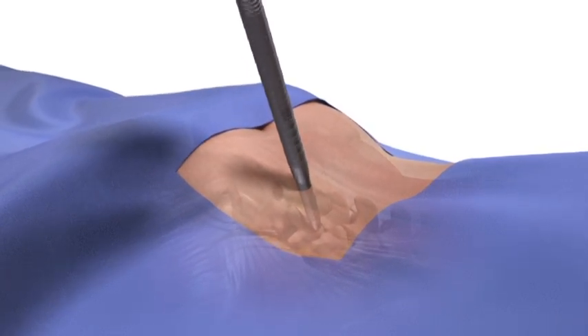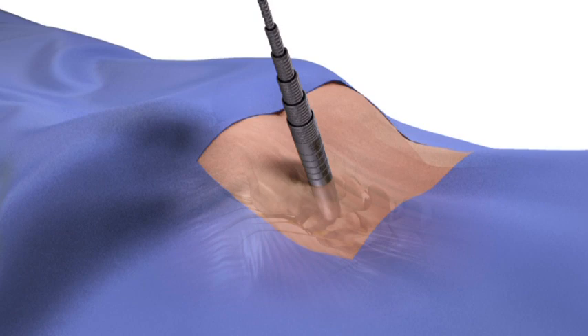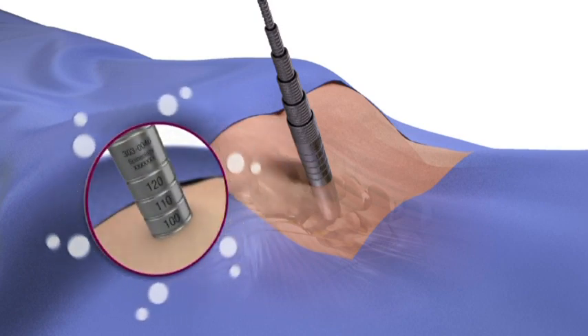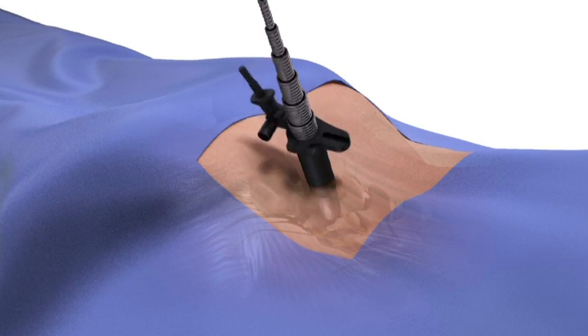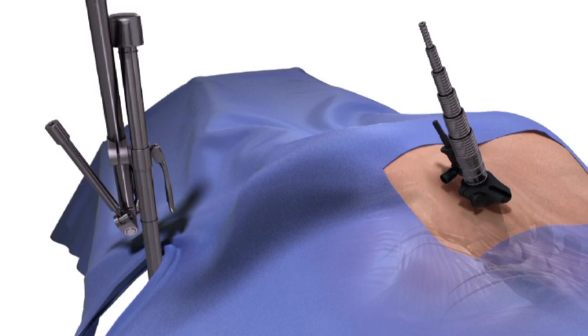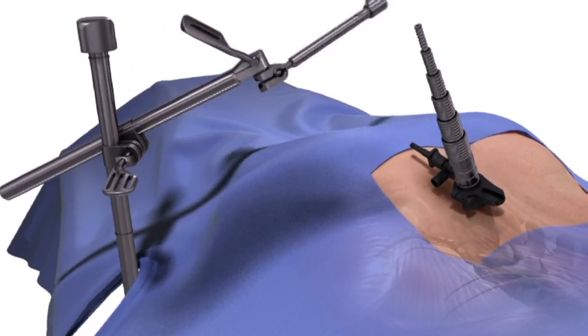Pass the dilators sequentially over the guide pin until the desired portal diameter is reached. Markings on the dilator indicate the correct length to choose. Attach the variable angle top ring to the selected retractor tube, then advance the retractor over the last dilator.